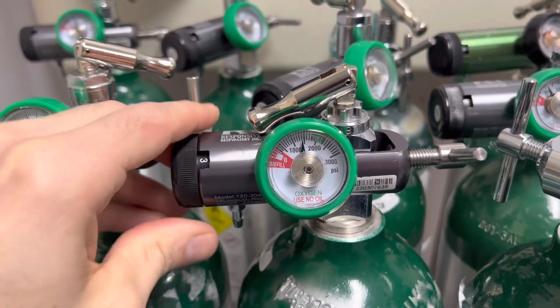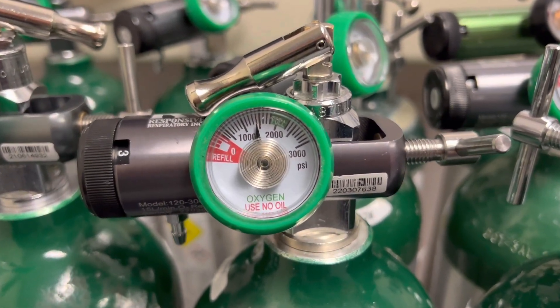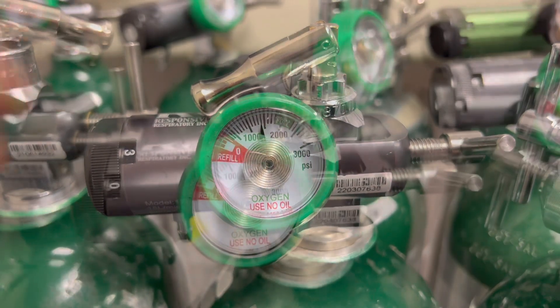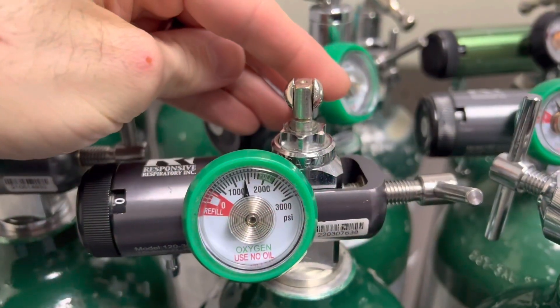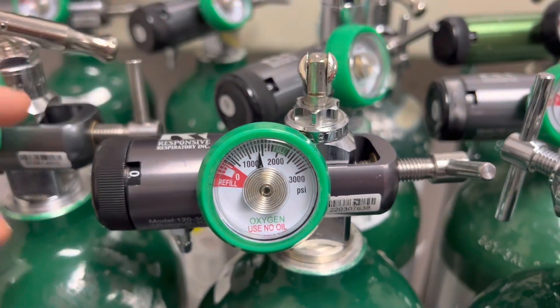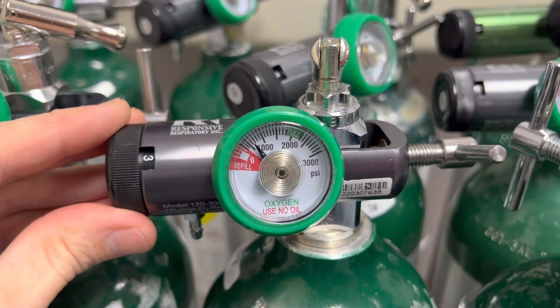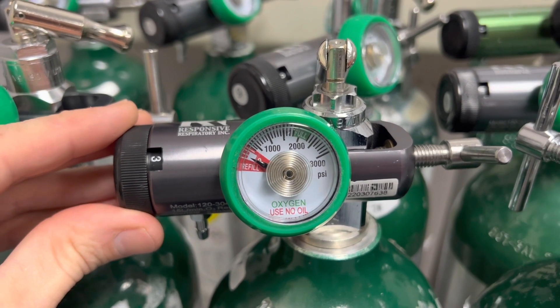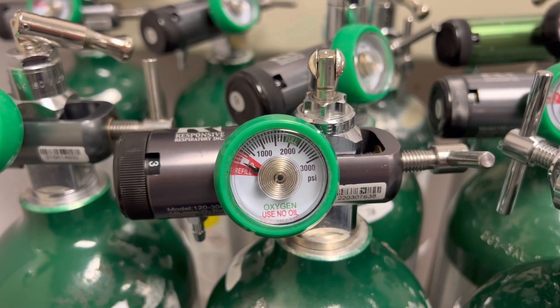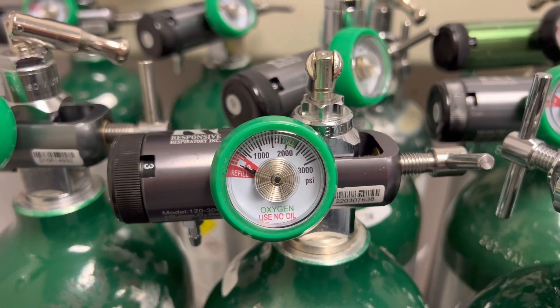Wait up to 15 seconds to verify that the pressure gauge reading is stable and that the PSI will meet your travel needs. If you forget to open the valve or mistakenly close it, watch what can happen. As you set the flow regulator knob, oxygen will flow initially, but if you don't wait for the pressure gauge reading to stabilize, you could fail to identify that oxygen flow has stopped because the valve is actually closed. This is a serious safety risk.